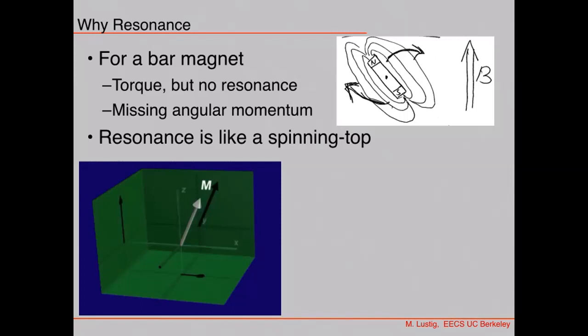No, so actually what they do is they put very small vials of water, and then they perform NMR experiments and look at different places in the volume. What is the resonance frequency? This is actually a way to measure the magnetic field very accurately through NMR.